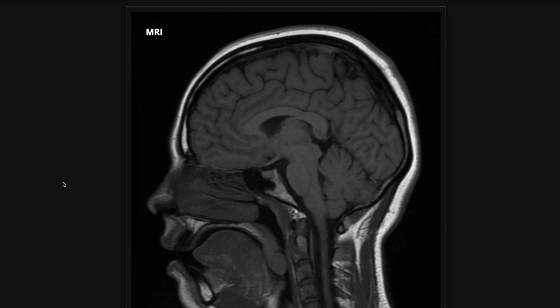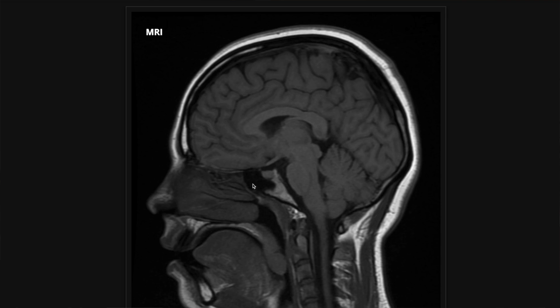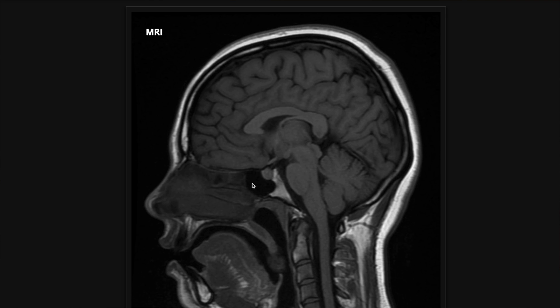There are a bunch of different sequences. The first one I'm going to start with is what I have on the screen here, and that is the T1. This is a sagittal view, so this is looking at the brain from the side of the patient. The sagittal T1 I predominantly use to look at normal anatomy. There are a few structures to point out on the midline sagittal — I'm not going to do every single one, but I'm going to do the major ones.